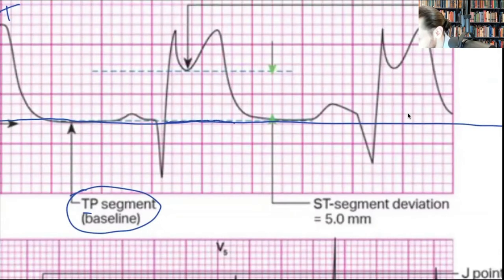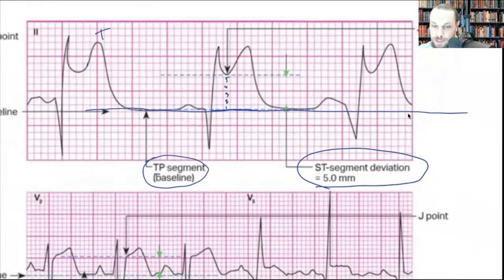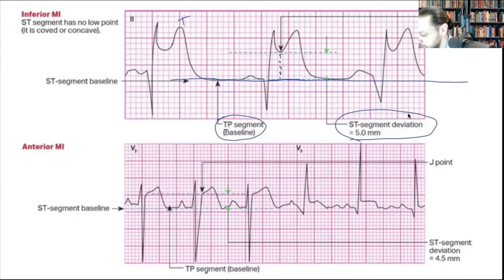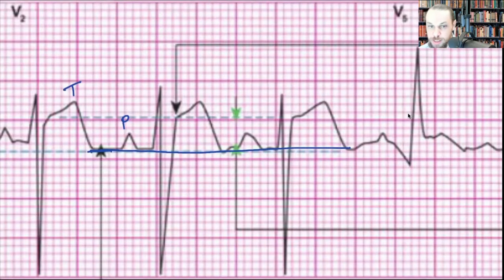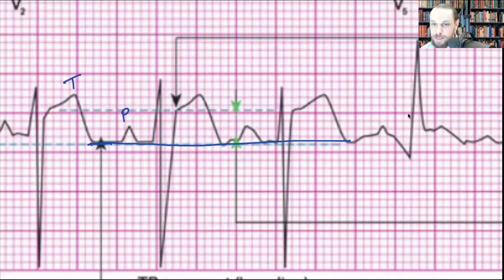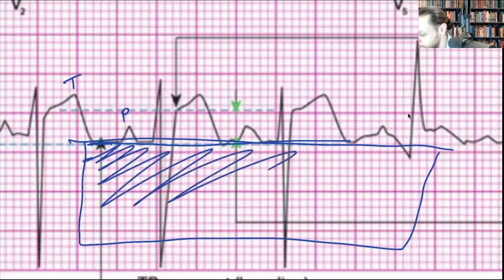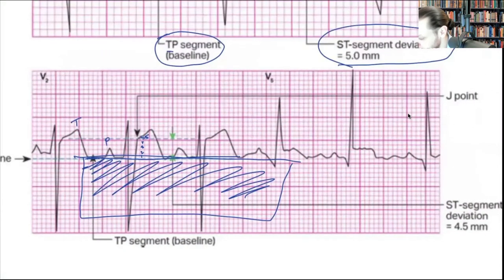Once I find my TP segment and draw my baseline, I count the boxes — one, two, three, four, five — and that gives me ST segment elevation of five millimeters. The bigger this amount, the more significant the MI. In the pre-hospital setting, I tear out EKG paper, fold it over my segment, and count the boxes — 4.5 boxes is a significant elevation.